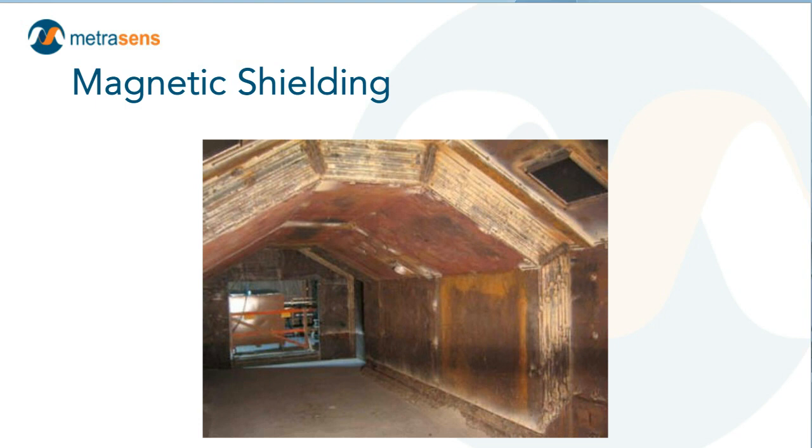Generally speaking, if you're squeezing the room to make it less costly to build, and then you wind up having to add magnetic shielding in to contain a magnetic field, you're probably at least as well off making the room bigger to contain the magnetic field from a cost standpoint, plus you may also be improving the clinical performance of the MRI by not having the distortions or the interference effects of the ferromagnetic shielding material.